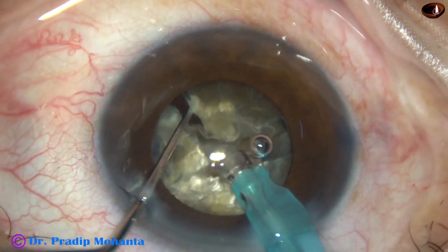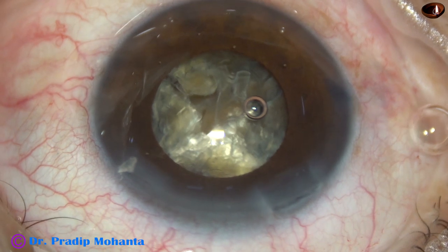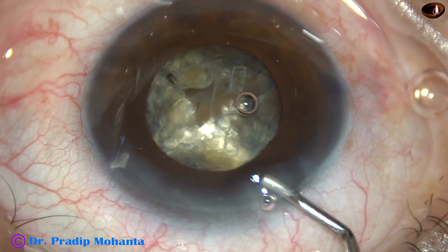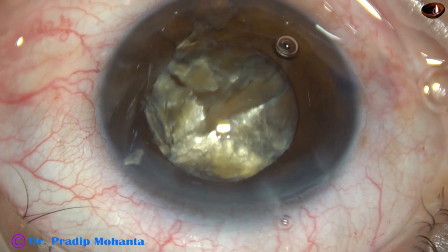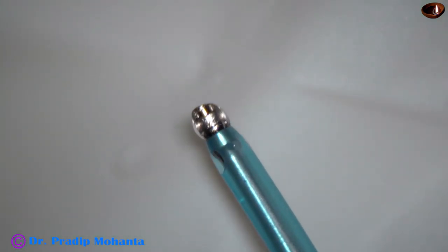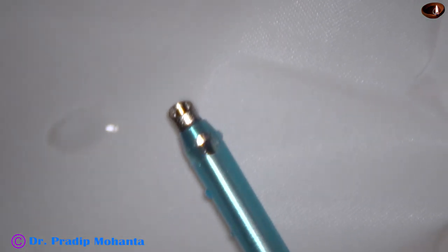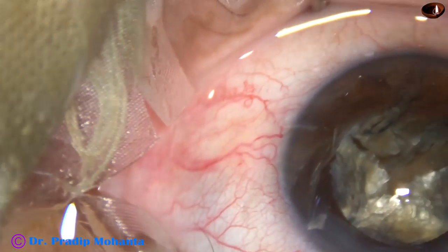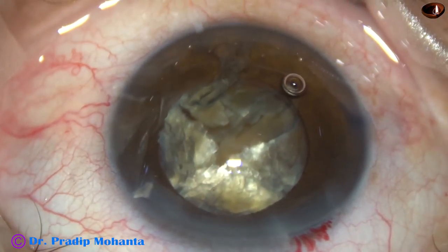This is a slow surgery and you can follow each and every step very easily. Visco again, and now the exposure of the FACO needle is decreased for emulsification of nuclear fragments, because if the exposure is more, the risk of posterior capsular rent is more.